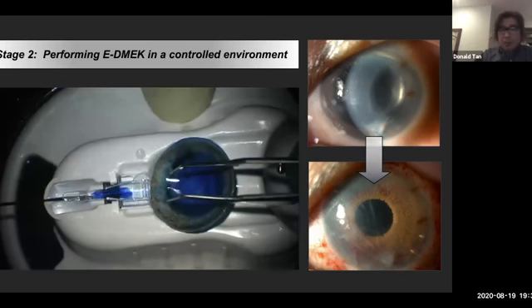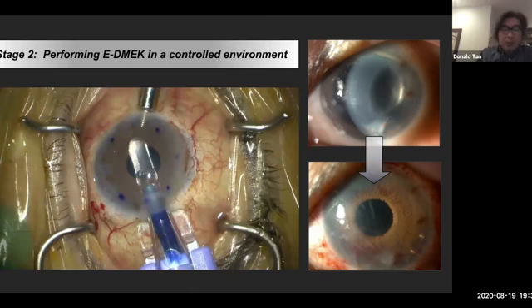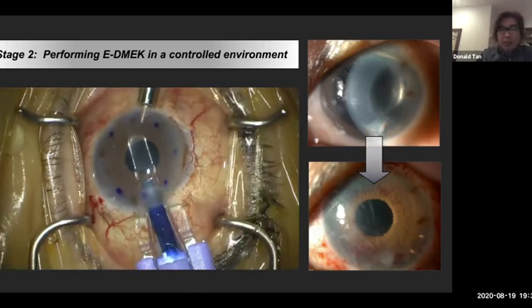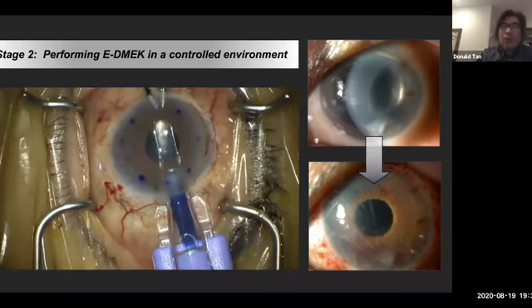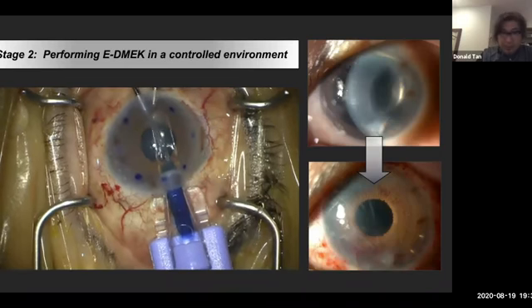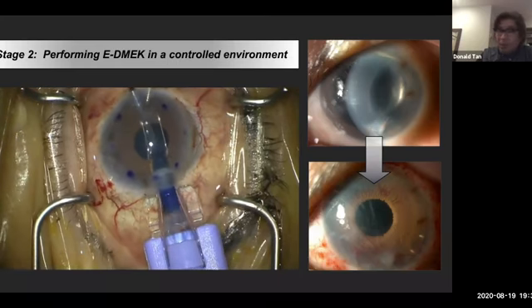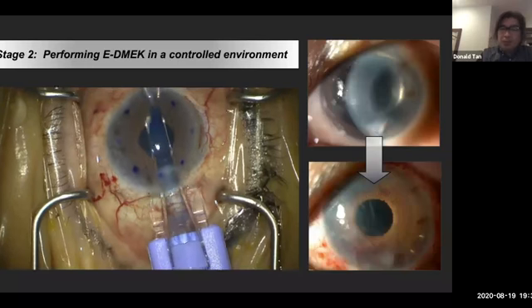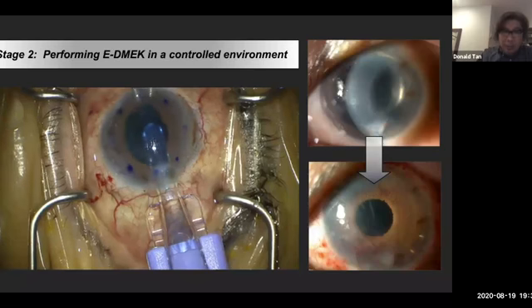And you'll see that the procedure for all these cases is very similar now. Now that you've normalized the anatomy of the anterior chamber, the iris is there, then the procedure becomes really quite straightforward. So this procedure becomes like a normal case. Now the chamber can be a little bit deeper than normal, but I don't see it as a big problem. The chamber can shallow, but it will not collapse. So in a way, that's quite good.